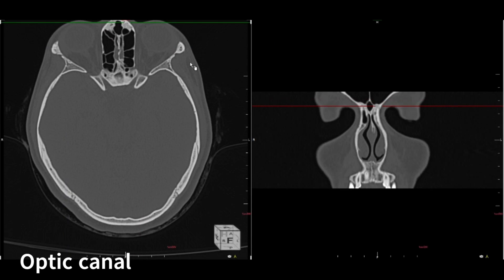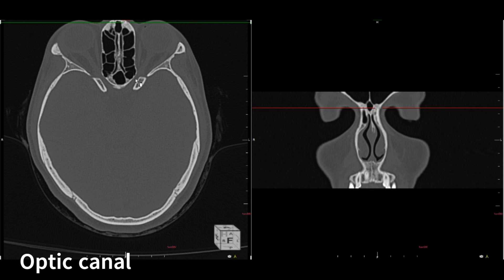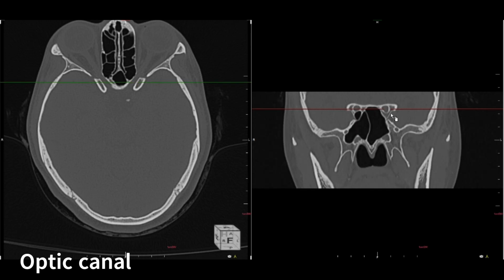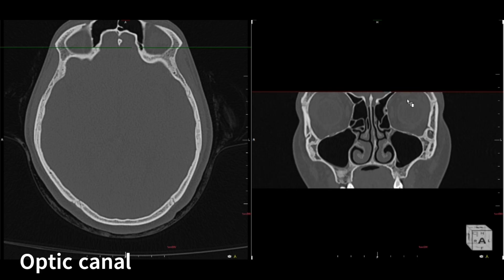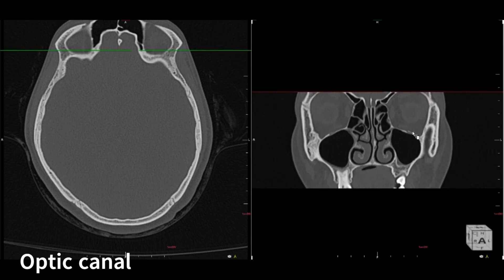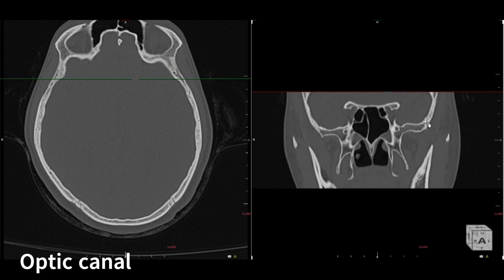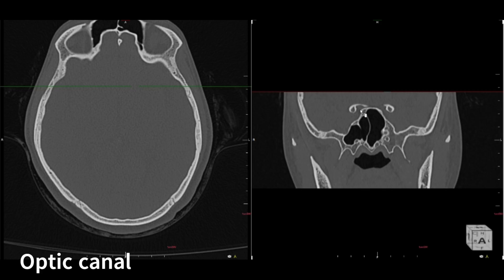Next we have the optic canal. First locate the globe, and posterior to the globe you can see the optic nerve passing through a bony canal — that bony canal is the optic canal. The optic nerve passes through the bony canal posteriorly to later form the chiasma behind it. On coronal, these two structures are the optic canals. Tracing from the globe posteriorly, you can see the optic nerve passing through the optic canal, which is adjacent to the sphenoid sinus.